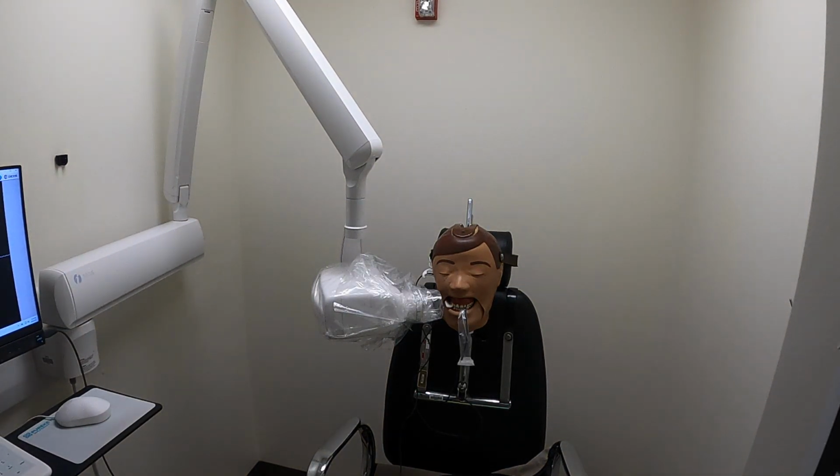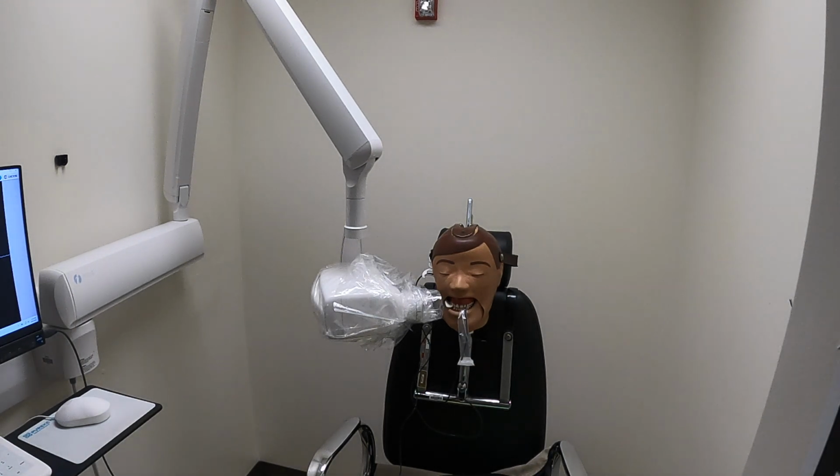The study doesn't show the same premolars. This is the central. Thank you.